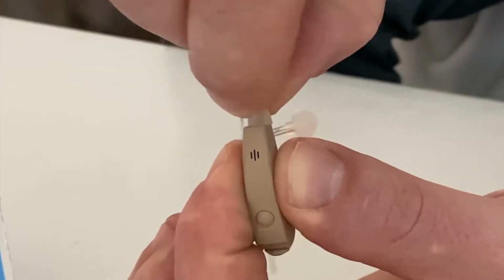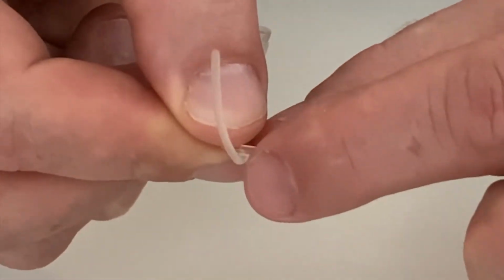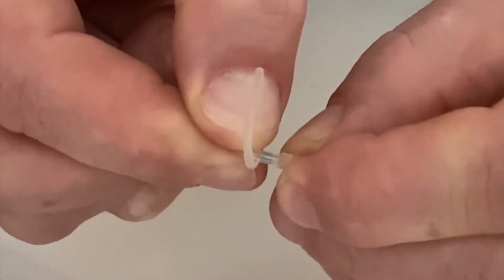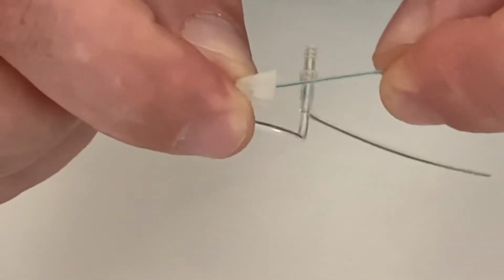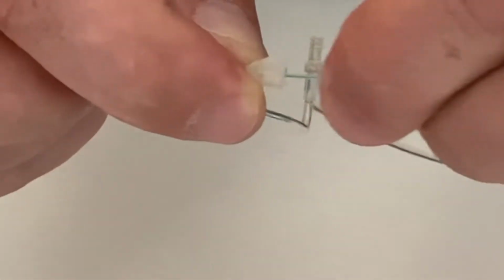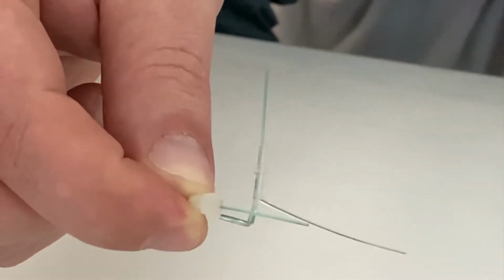Step 1. Remove sound tube. Step 2. Remove ear dome from the sound tube by inverting ear dome and pulling straight off. Step 3. Insert the wire through the base of the sound tube. Step 4. Thread wire through tubing base and out the tip.